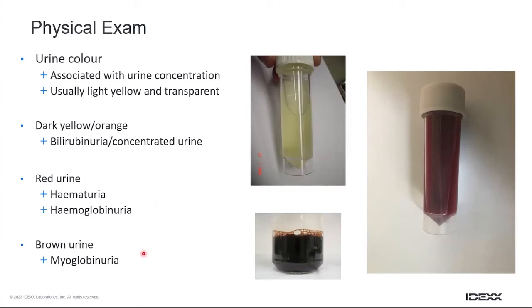And then lastly, the other type of urine you might see is myoglobinuria, which is quite uncommon, and it tends to look fairly brown. So this kind of dark color that you can see on the bottom image here. So in Mukat's case, we spun the sample down and we confirmed that it was chock-a-block full of red cells consistent with hematuria.